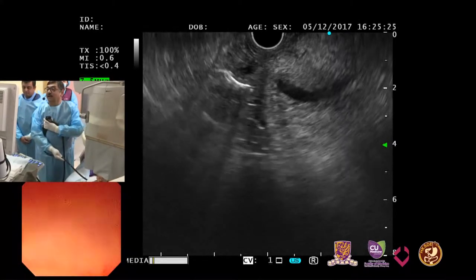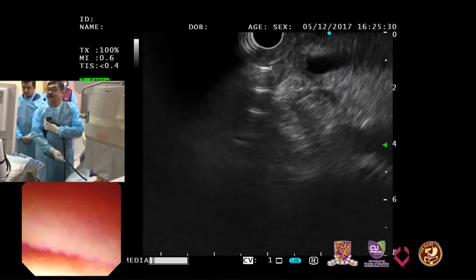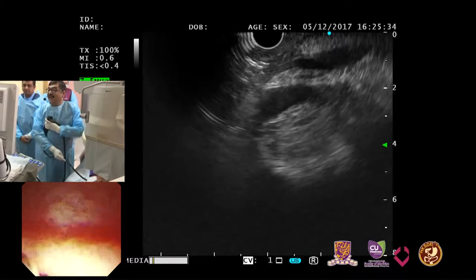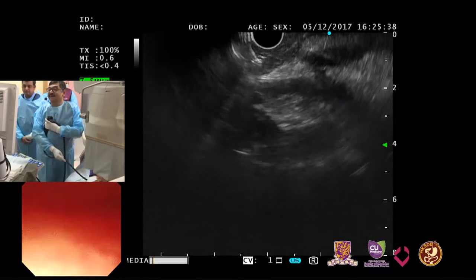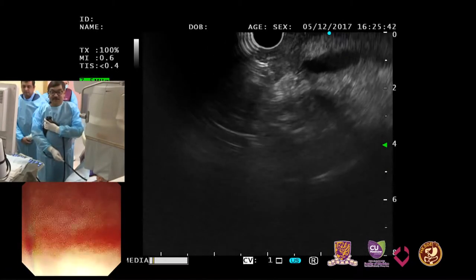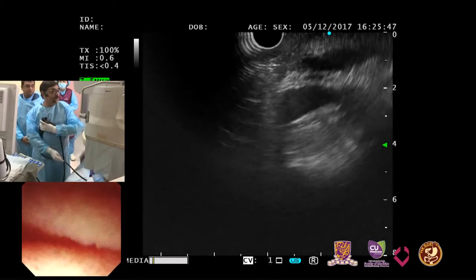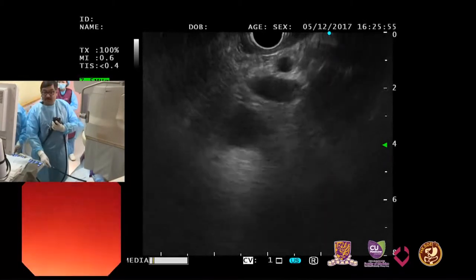I think, Dr. Dhir, we were hoping that you would show us an EUS-guided rendezvous procedure. I would have loved to do that. Although you can't demonstrate it to us, perhaps you can share with us, sometimes after puncturing the CBD from the duodenum, the wire can go up to the hilum. So how do you get it to go down into the papilla? I'll show you the positions, please.